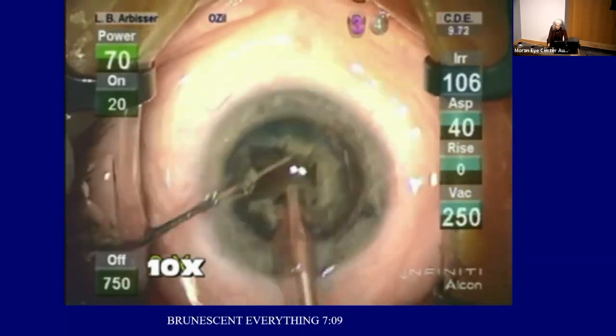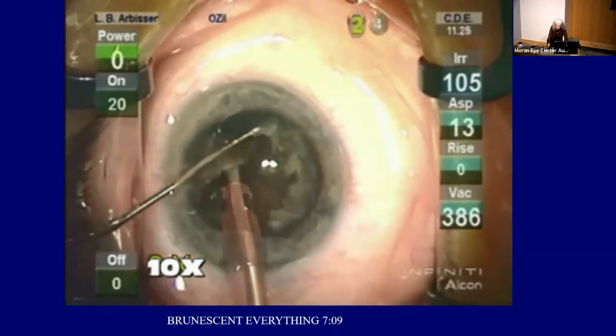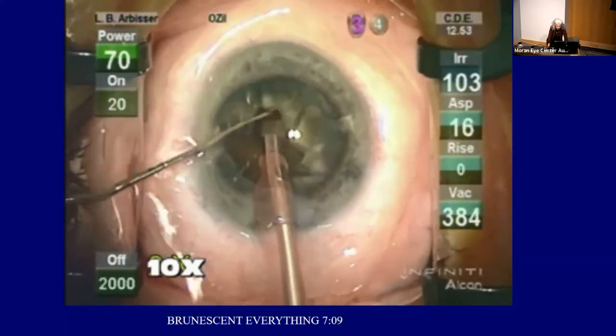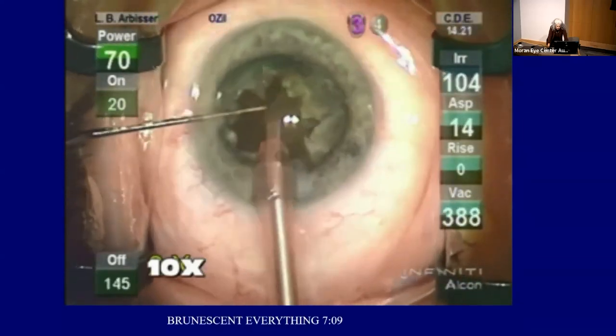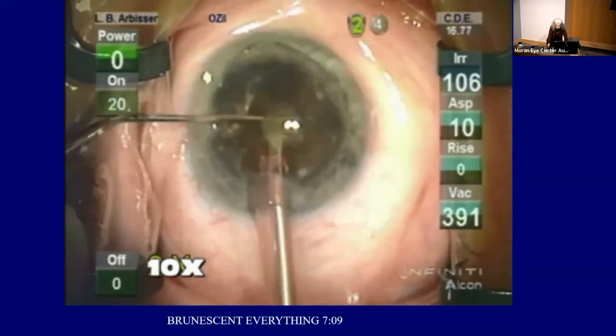Yes. On panel mode? Yes. Oh, thanks. It seems like all your settings are on panel mode on the overlay. I find that I have better control if I keep something on linear. I usually keep my vacuum on linear and keep aspiration on panel.